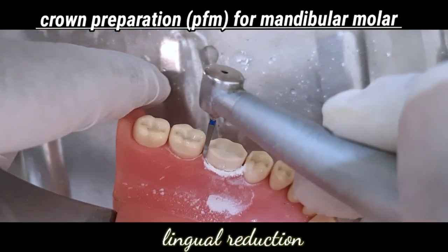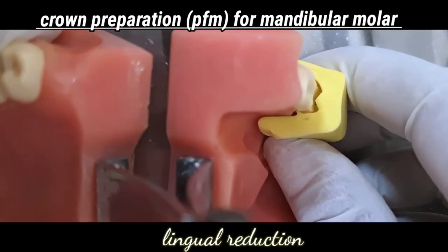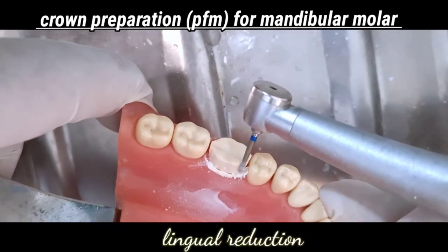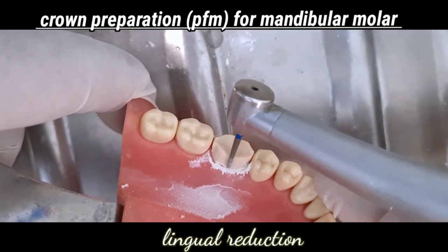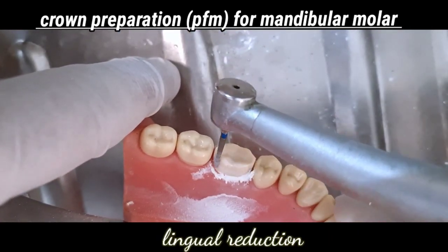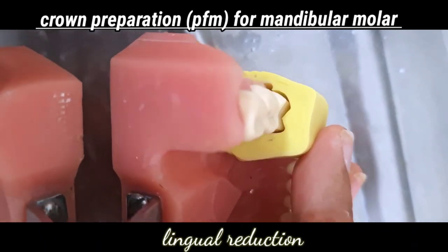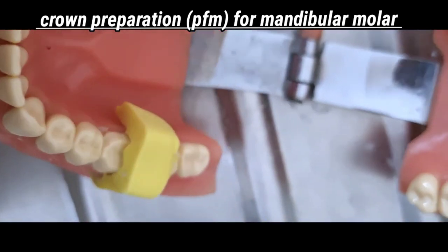If you are using metal on the lingual surface for a PFM, give a deep chamfer for a lingual metal collar. But nowadays we mask porcelain all over the metal, all throughout the crown. So in that case, we continue with a modified shoulder margin. Check the tooth preparation with a putty index, the amount and configuration of the tooth preparation we achieved. So a uniform reduction is achieved, which is checked via a putty index.